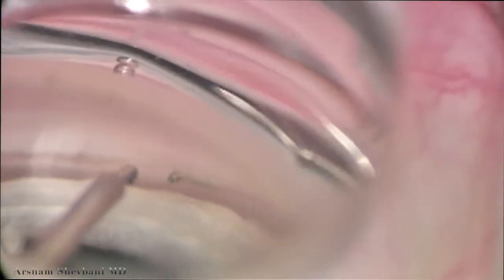Now many people might leave it this way. However, I personally don't think that these stents are going to be as efficacious in that setting. So we use a pair of micro-graspers here. We're going to reposition the stent within the lumen of the canal. Again, this is all viewed through the gonioprism, and as you can see, the optics are actually very, very good for this type of maneuver.